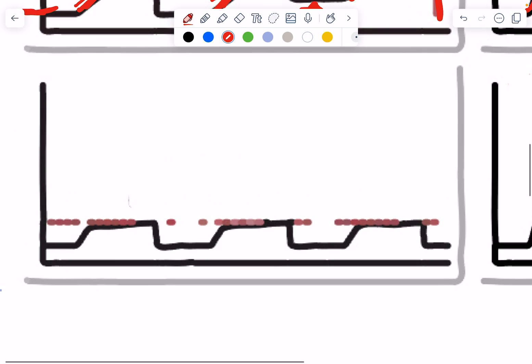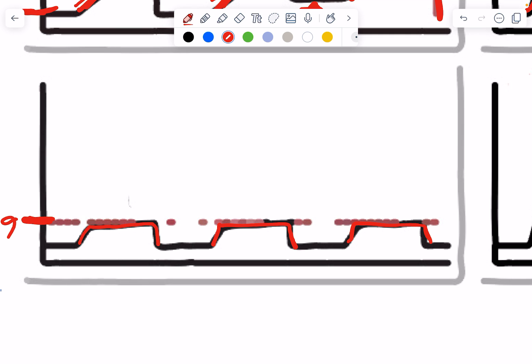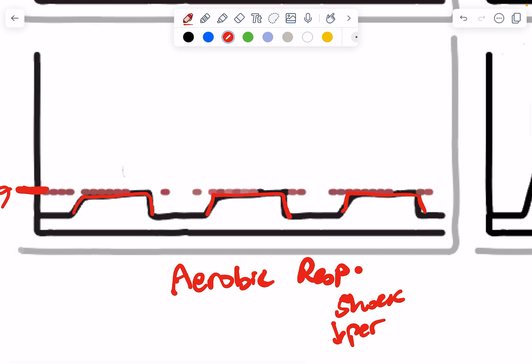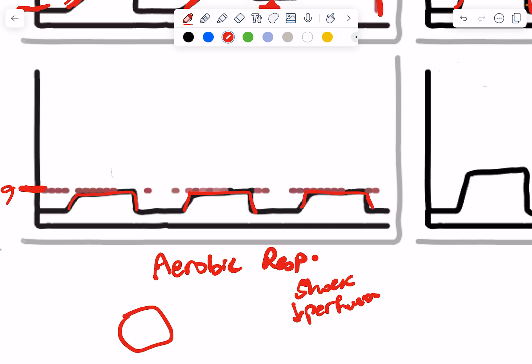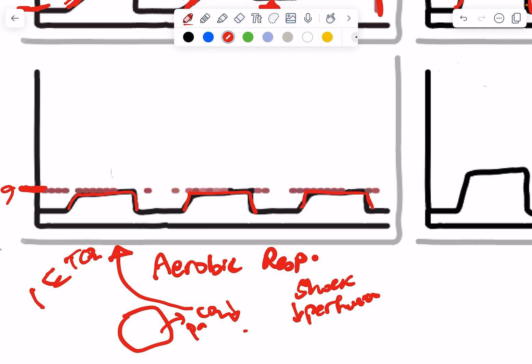Now let's take a look at this. The waveform looks normal, but it's kind of blunted. You can see here that the baseline is really low. It's around 20 or even less, about 9 or something. So that means the patient has an issue with aerobic respiration. This patient could be in shock with decreased perfusion. This patient could be in cardiac arrest, meaning that not enough oxygen is reaching the tissues to begin with. So the tissues are not producing enough CO2. So the PaCO2 itself is really low because the tissues are doing anaerobic metabolism. And therefore, whatever is respired and exhaled out, end tidal CO2 is also low. And so the entire baseline is low, even though respiration is normal. So there's nothing wrong with ventilation, but there's something wrong with metabolism and perfusion.